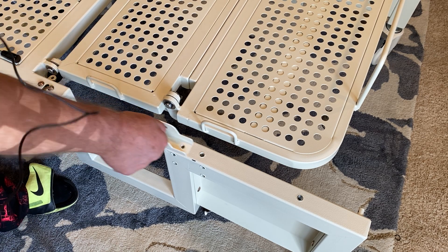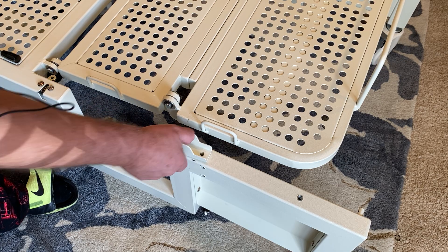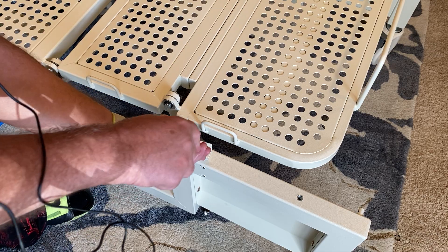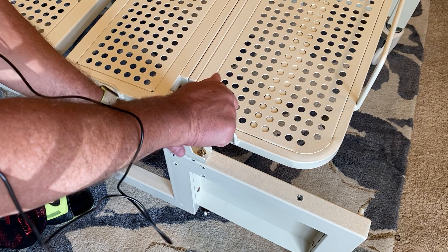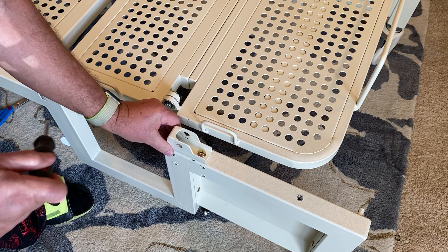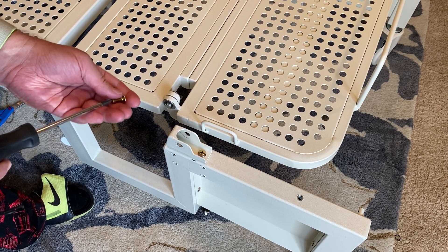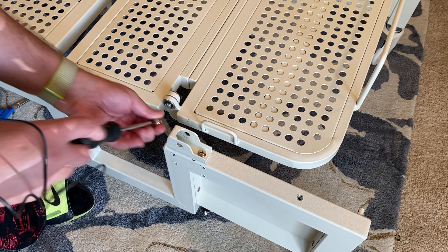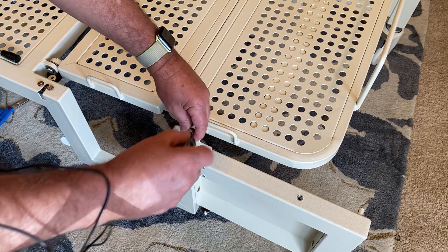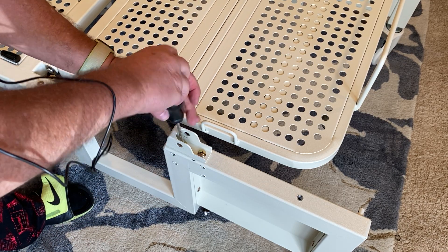Now we're going to attach the bracket for mounting the table, and this is just two screws. Pretty straightforward. Put those in there like that. Just note that the opening is headed towards the back of the bed, towards the foot. And you've got to do these first. If you try to do them in reverse order, then you can't get to these screws to attach them to the bed well.